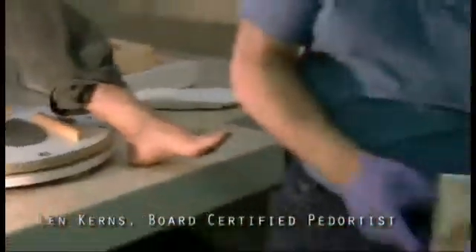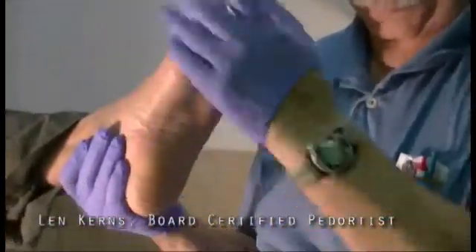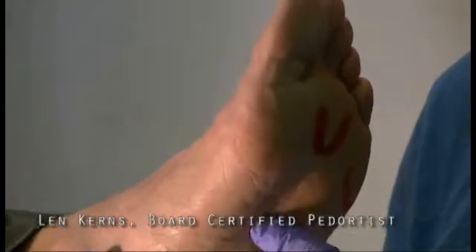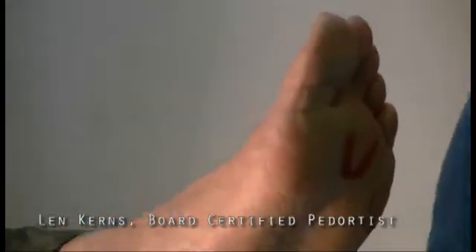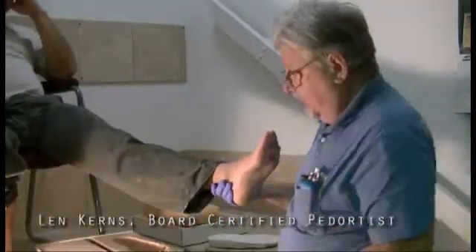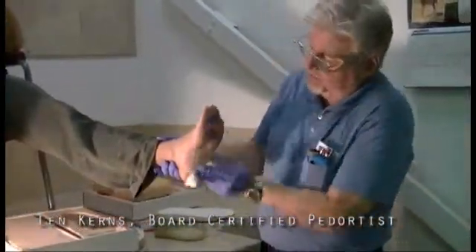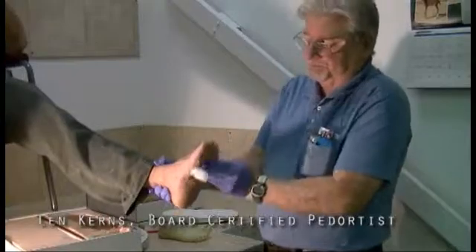And as you can see, it left the lipstick marks in here. And you could actually push it down with your finger to show it to me, or leave a lipstick mark in here. Or if you're a DPM, you put a fancy pad on here, a star shape, a metatarsal pad. Patient came back, you cut some fancy pad. You can leave the pad on or the moleskin, and it would make an impression on the foam, and we would see exactly the spot you're talking about and follow your instructions to take care of it. Now also keep a box of baby wipes so you can wipe off the lipstick.